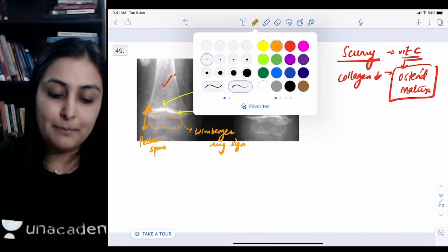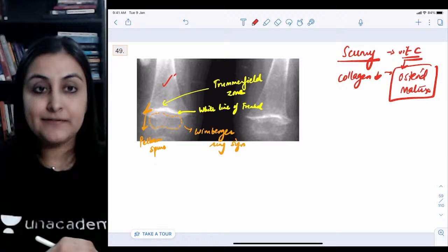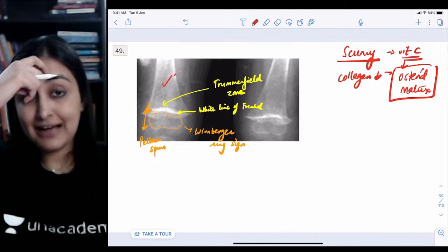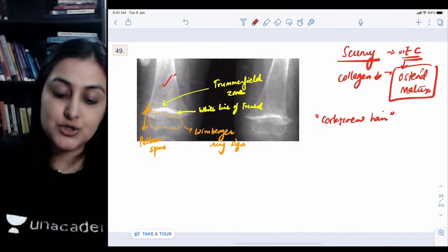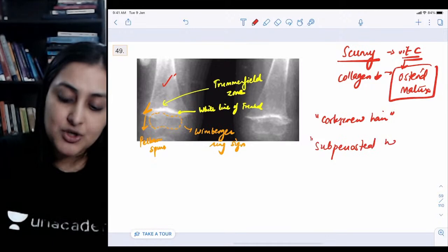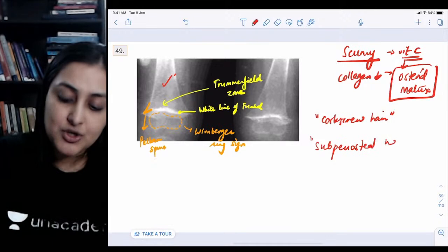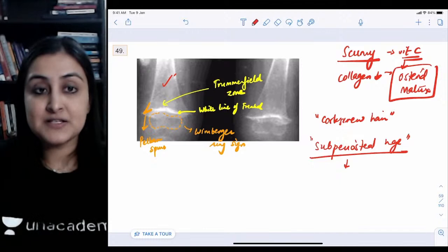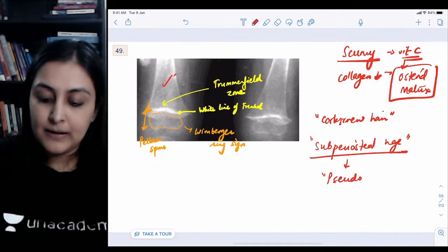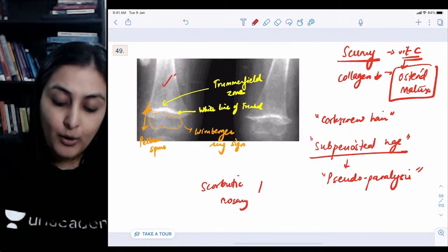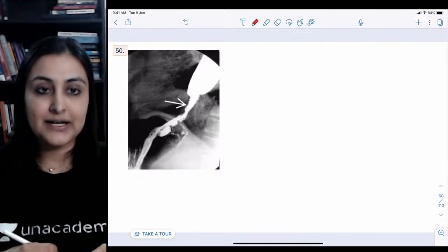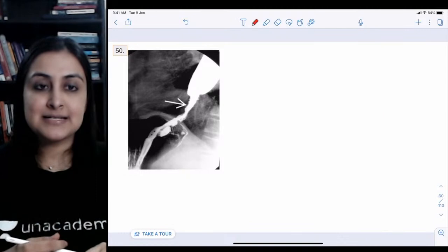In scurvy, deficient collagen means bleeding — bleeding gums, perifollicular bleeding giving a corkscrew hair appearance. Subperiosteal hemorrhage causes severe pain, so the baby won't move — called pseudoparalysis. Scorbutic rosary: pointy and painful. Summary: rickets vs. scurvy — irregular metaphyses vs. smooth white metaphyses; rachitic rosary rounded/non-tender vs. scorbutic rosary pointy/painful.